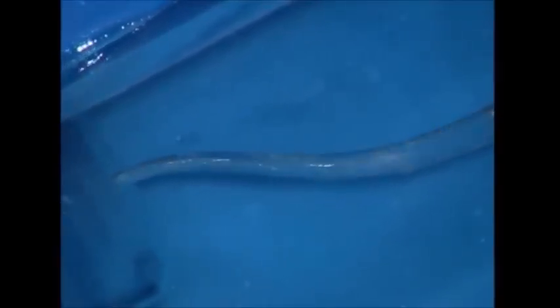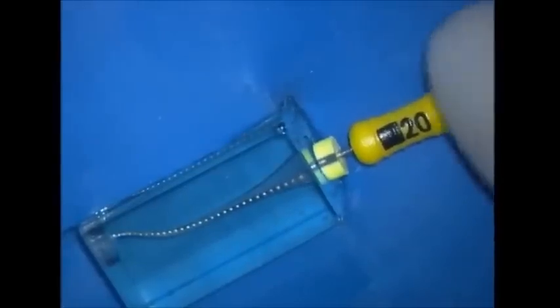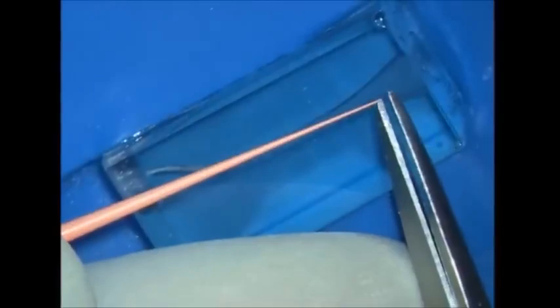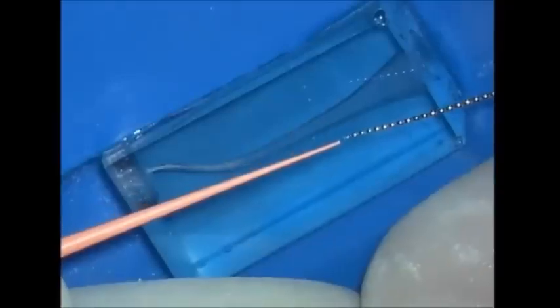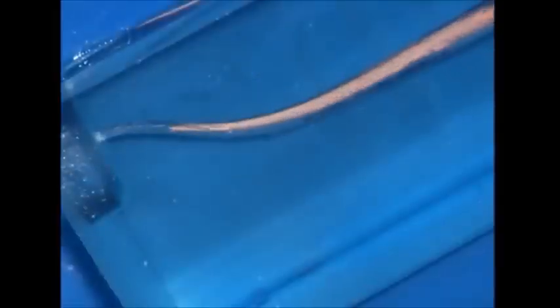When the canal has been optimally cleaned, we want to gauge the foramen with a 20 hand file. By tapping on the handle gently, we can determine if the file is snug at length or loose at length. A medium, non-standardized master cone is selected and trimmed so that its apical diameter matches the last file that was snug at length. The cone is fit in a fluid-filled canal. Following Type 1 ledge management, notice how easily and freely the master cone slides to length.